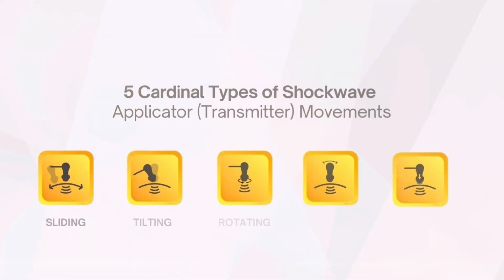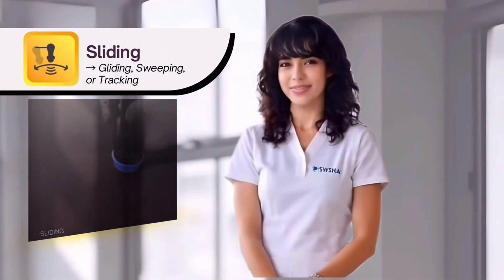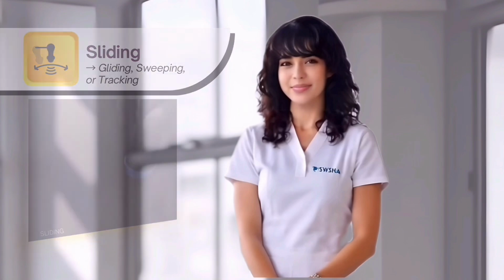Both shockwave application techniques can be modified by these 5 cardinal transducer movements. The 5 cardinal movements used during shockwave treatment are: sliding, a smooth back-and-forth movement along a tendon or fascia, ideal for scanning large tissue areas.